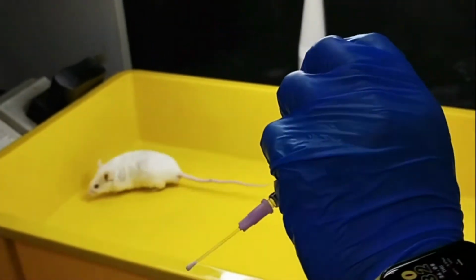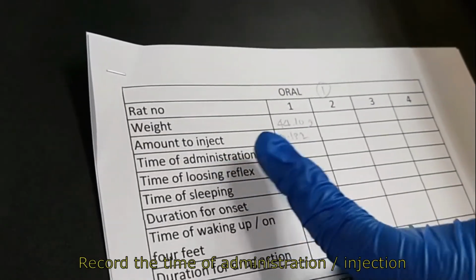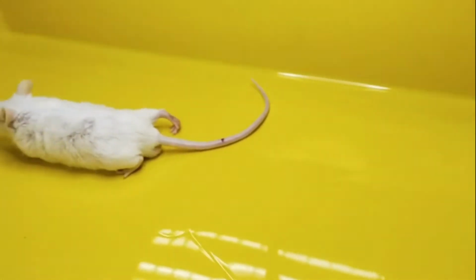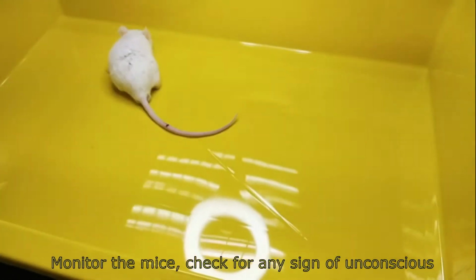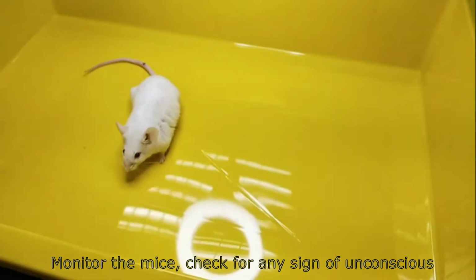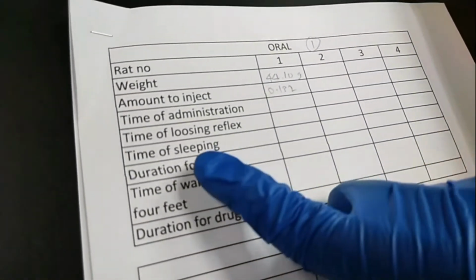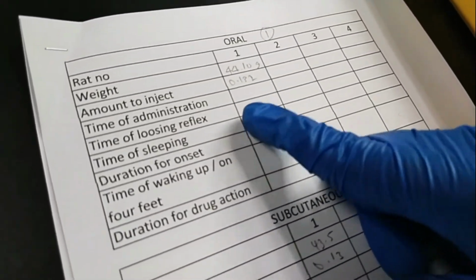So we need to look at our watch, and now it's already 10:32 AM. So we're going to record the time of administration here. We have the time of administration to record the current time. And from here we need to monitor the mice for a few minutes and see whether the mice are losing their reflex, losing their balance. And after the mice are losing their balance, then you need to record again the current time, which is this one, the time of losing reflex. Okay, so you need to record the current time when the animal is losing their reflex.